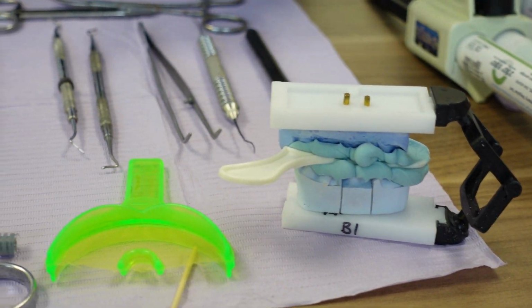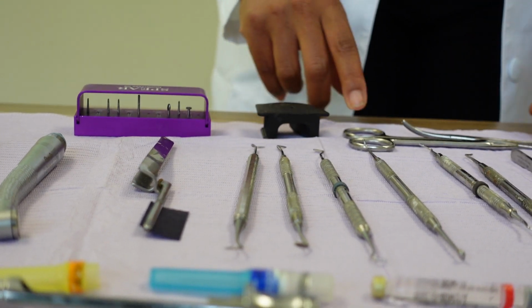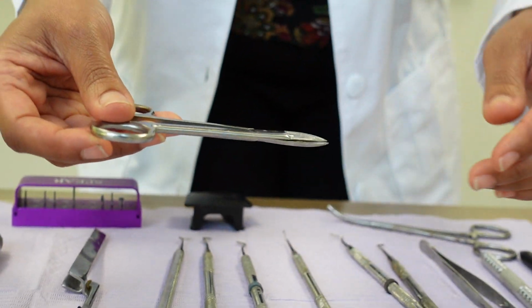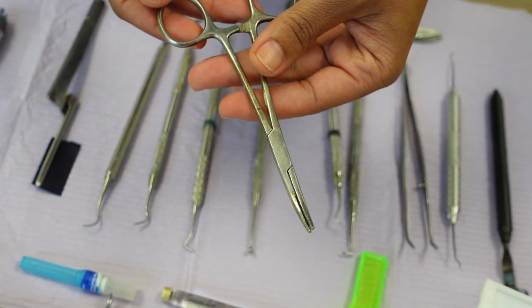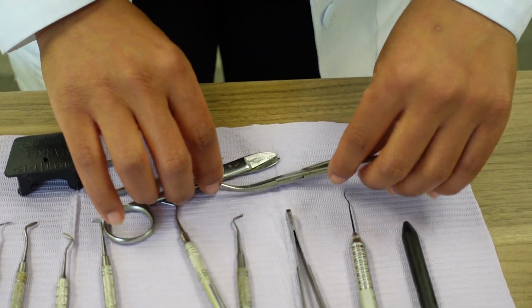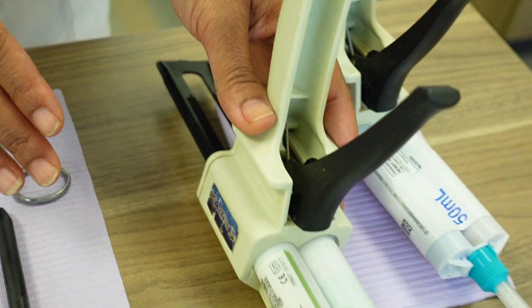This right here is your burr block, of course. Mouth prop. Next is your crown prep scissors. This is used to cut retraction cord. This is used to remove anything that's in the mouth, as far as any instrumentation-type things like a matrix band or wedge.